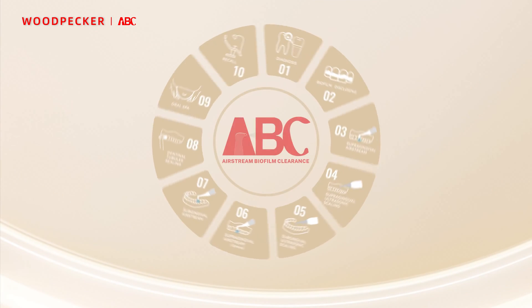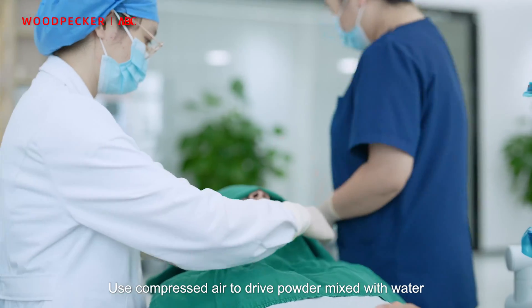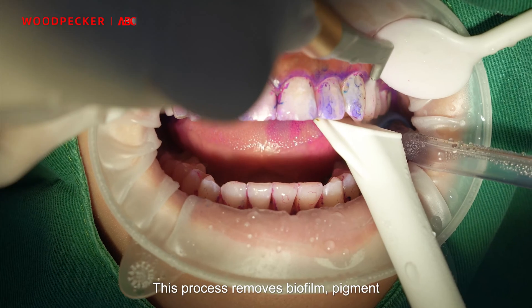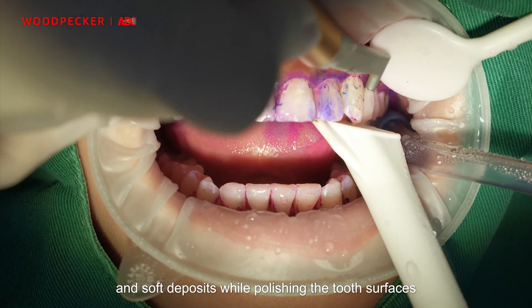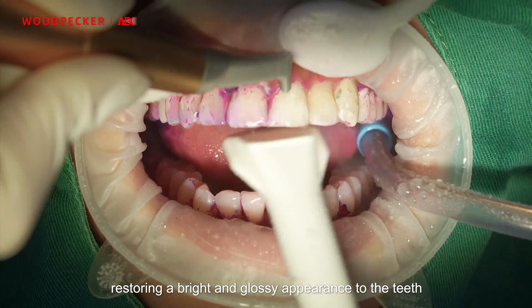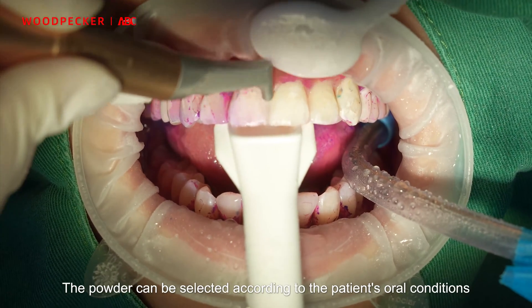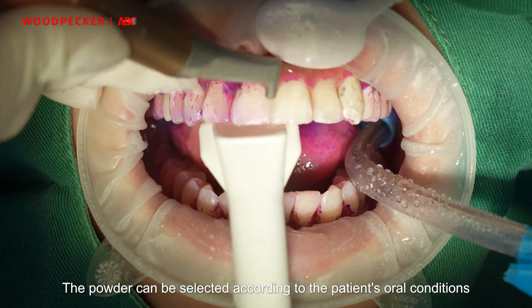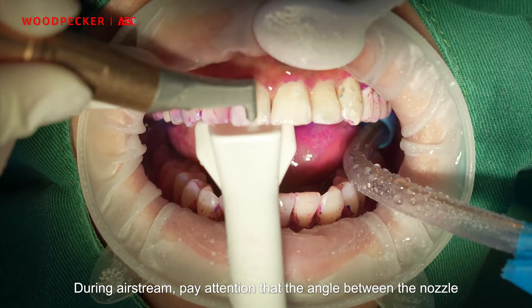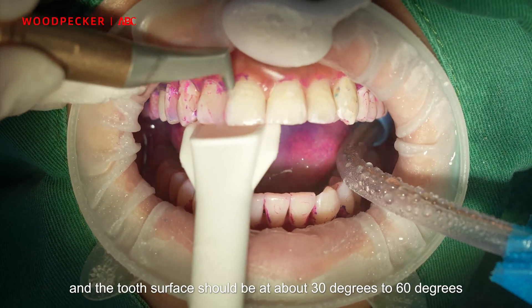Step 3: Supra-Gingival Airstream. Use compressed air to drive powder mixed with water through an Airstream device onto the tooth surface. This process removes biofilm, pigments, and soft deposits while polishing the tooth surfaces, restoring a bright and glossy appearance to the teeth. The powder can be selected according to the patient's oral conditions. During Airstream, pay attention that the angle between the nozzle and the tooth surface should be at about 30 to 60 degrees.